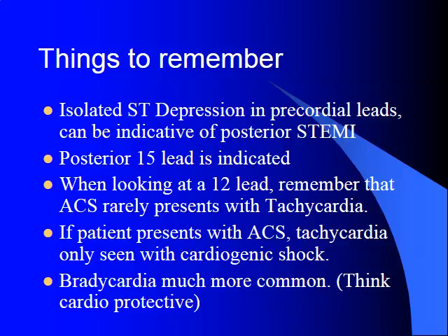Whenever we have ST depression isolated in the generally anterior precordial leads, we need to do a posterior 15 lead to look for that reverse elevation that I was talking about. So what we have here is ST depression when we're looking from the front, and it's a mirror image of an infarction on the posterior side of the heart. So we have to put those electrodes on the posterior side of the body to see the elevation.